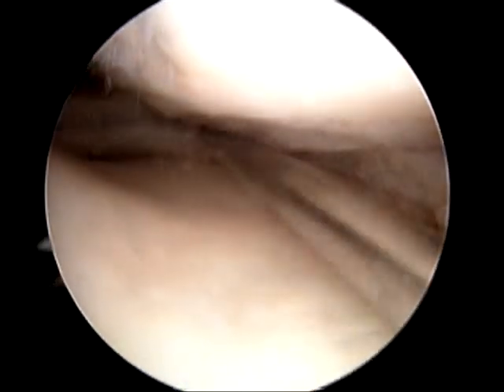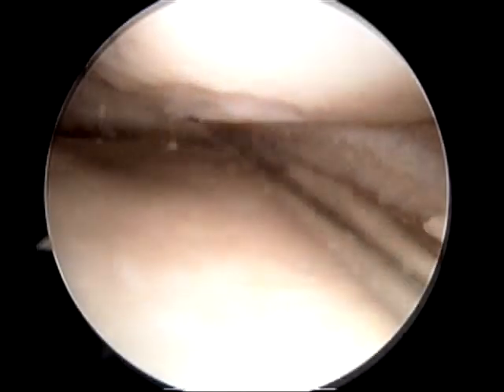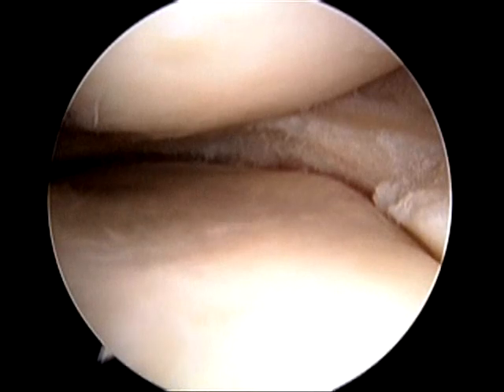Once I am satisfied everything is done in the knee, I will probe the cartilage one final time, take a picture, and get the patient on the road to recovery.